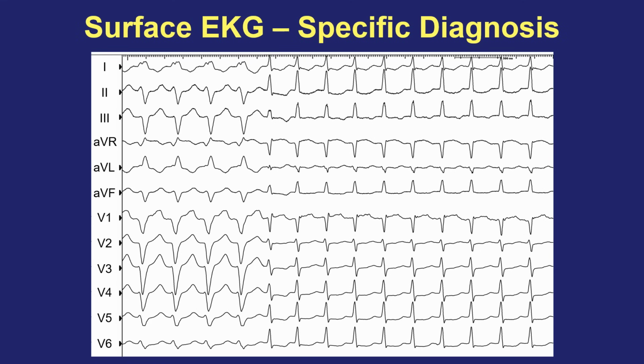And here's a classic example that you're going to see on board exams because it's such a cool observation when you see this spontaneous occurrence during tachycardia. Look at the tachycardia change in its QRS morphology. We can see over here to the left you have a wide complex QRS in a left bundle branch block pattern, and then it switches to narrow.